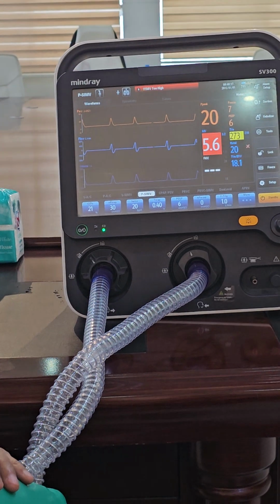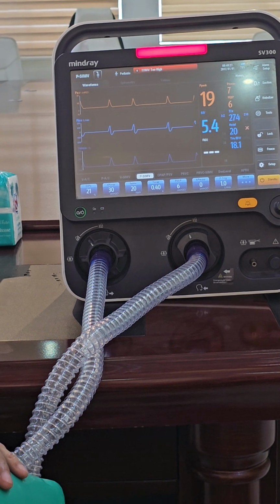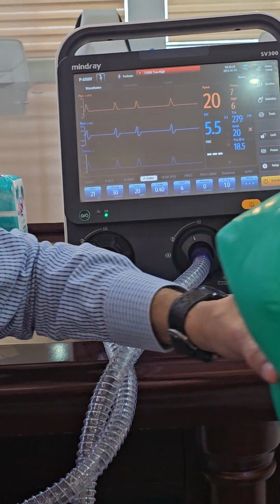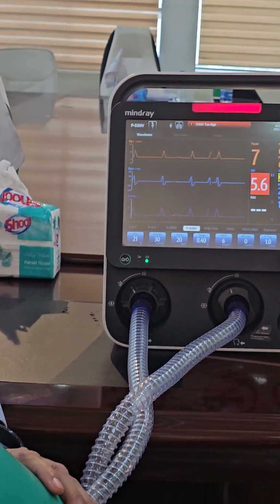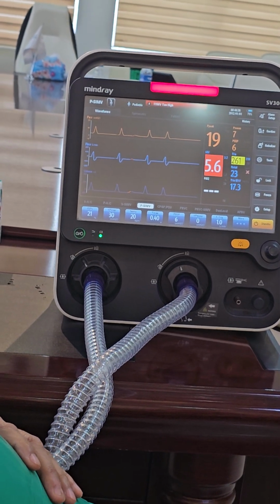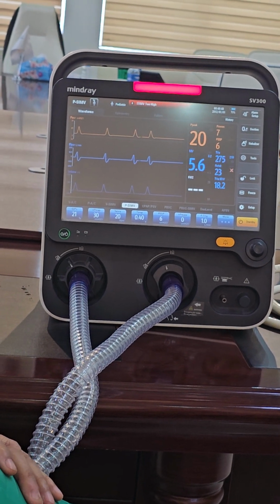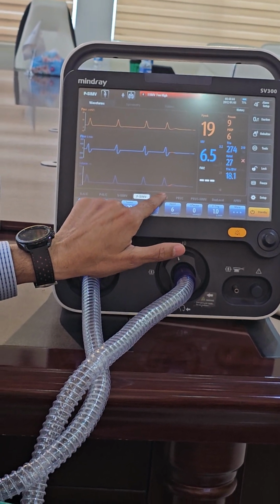So that's why when you have low CO2 and the patient is breathing 60 on assisted control, we switch to SIMV. You will learn that in the future, but that's the difference. The rest are the same. In SIMV, there is no assist, only spontaneous and mandatory. In assisted control, there is no spontaneous, only mandatory and assisted. Clear?